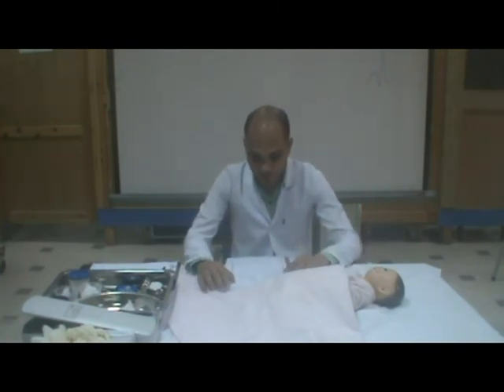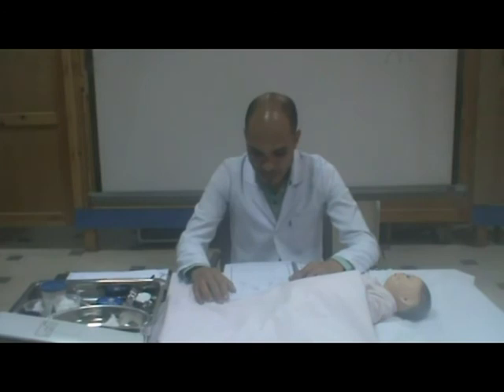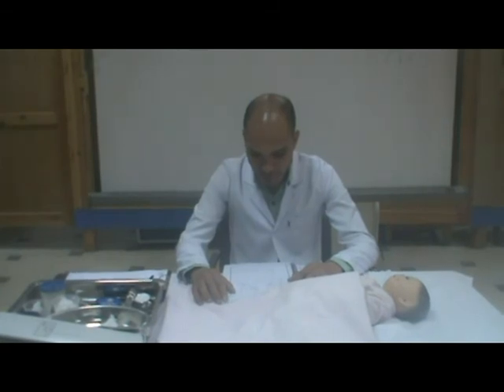Guidelines for determining blood pressure. Limb size and the cuff selection must accommodate the circumference. Excessive pressure on the antecubital fossa affects the sound. Children easily become anxious, which can elevate blood pressure. Blood pressure values change with age and growth.